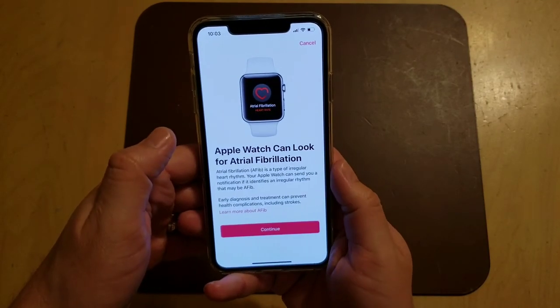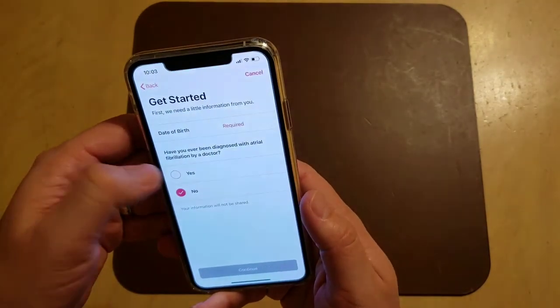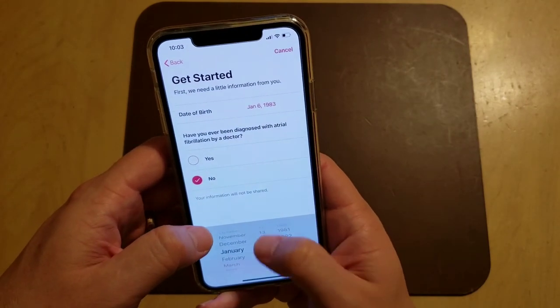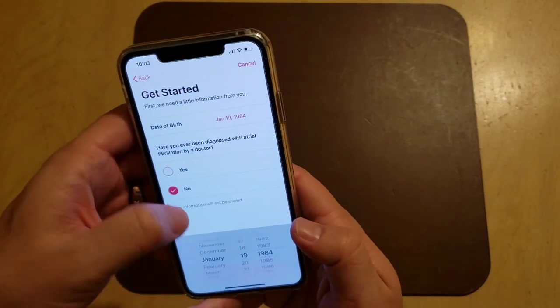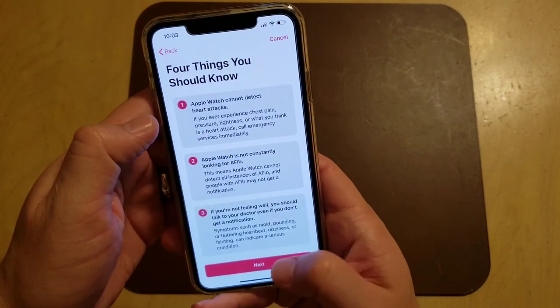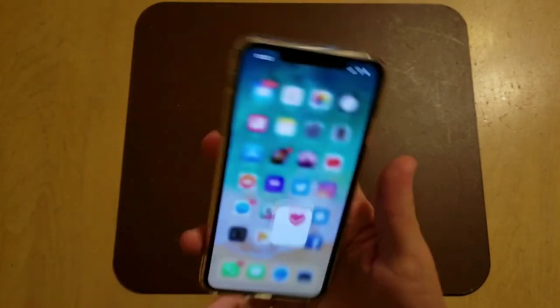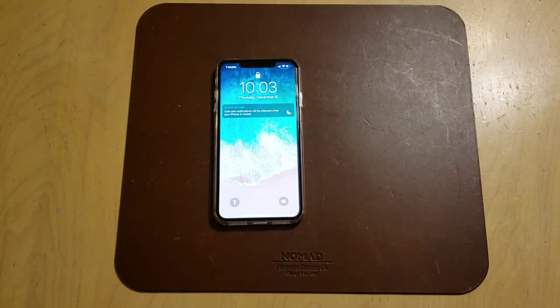I'm going to set up the irregular rhythm notifications now. Enter your date of birth, confirm you've never been told you have AFib, and turn on notifications. We should be all set up now — we're all good to go. We're now able to do ECGs on our iPhones and our Apple Watch Series 4s.